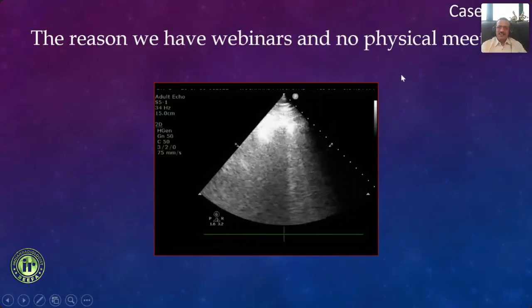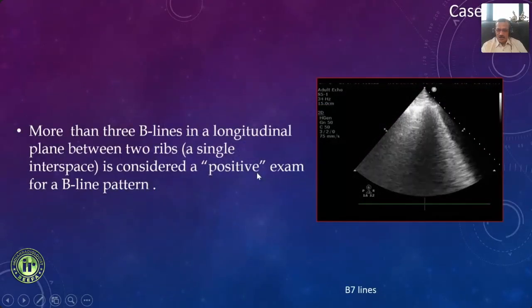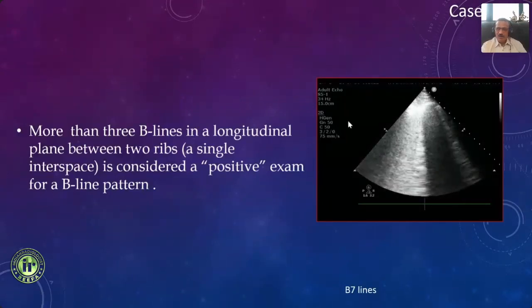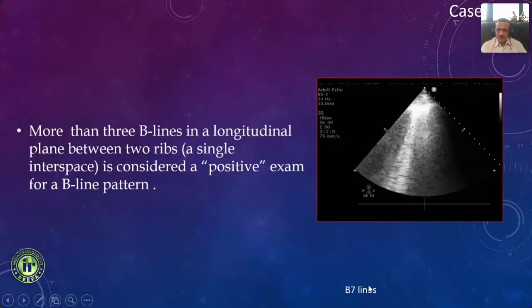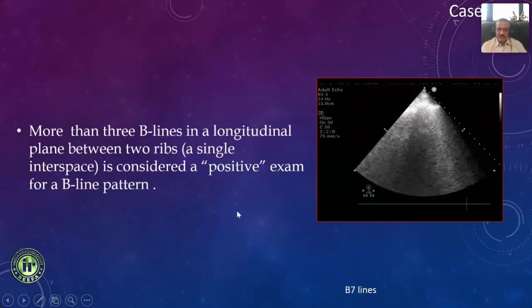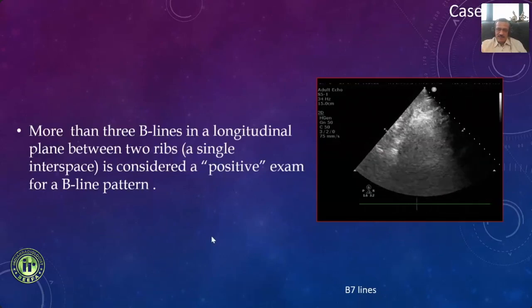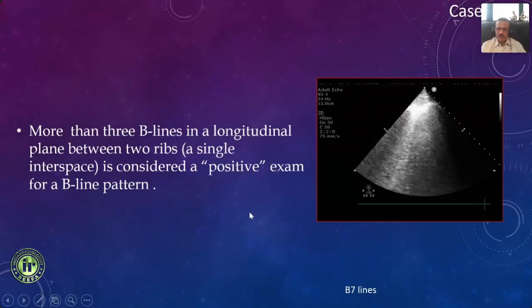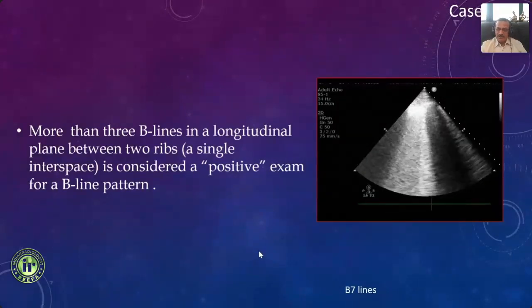Very good. Fantastic. So nowadays in this COVID era, we do lung ultrasounds in the ICU, and in fact it has become very popular. What you are looking out for are these excessive B lines. So this is known as B7 lines, where you see excessive B lines. If you have more than 3-4 lines in one intercostal space, and you might have patches of these B lines at multiple places, that is very often seen in COVID pneumonias or interstitial disease. Basically, it tells us there's fluid collection, and we can have patches of this in the lung.